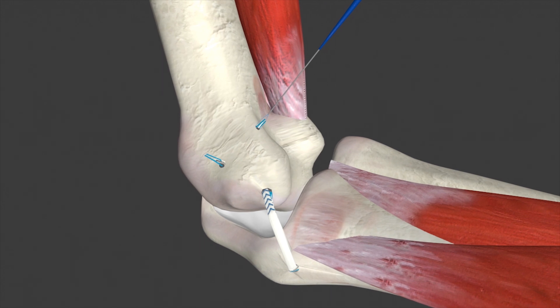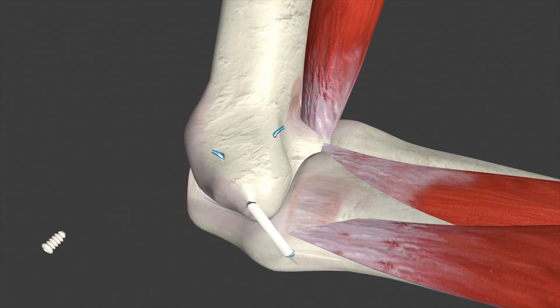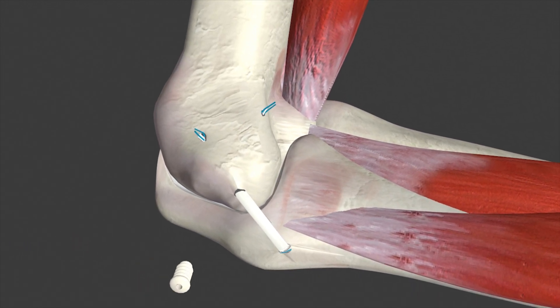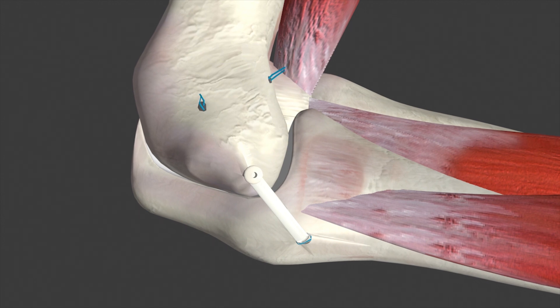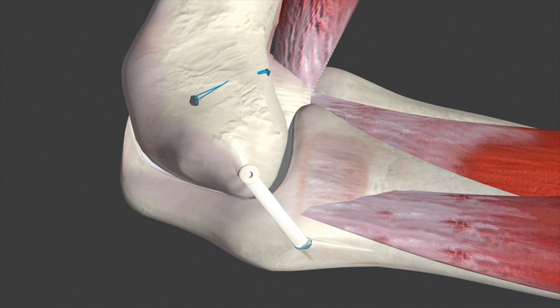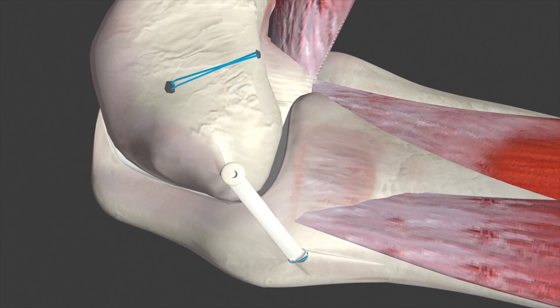This process is used for both holes. Now, the surgeon will wedge the graft into the socket using a screw to create a tight fit. This is done with the elbow slightly flexed and in a neutral position. Finally, the surgeon will apply tension to the sutures and tie them together. The result is a ligament that is nice and taut.